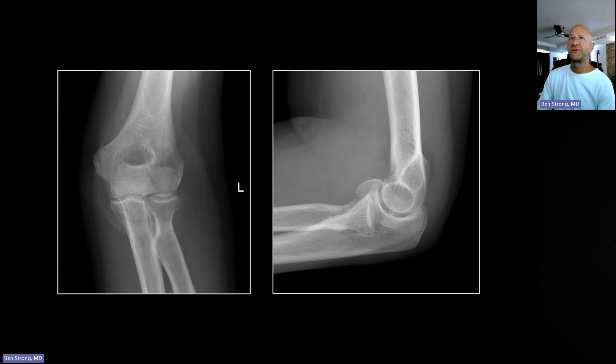Here are some less common fractures. This is a capitellar fracture. There is no proper undersurface of the capitellum visible because it has fractured and rotated superiorly. The cortex of the capitellum, which should be along the distal humerus, is now superimposed over it.